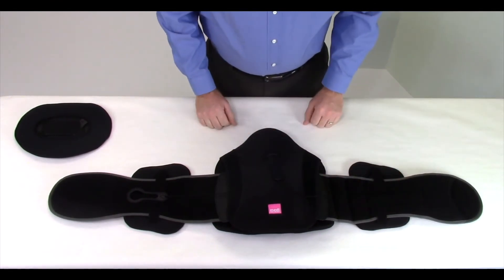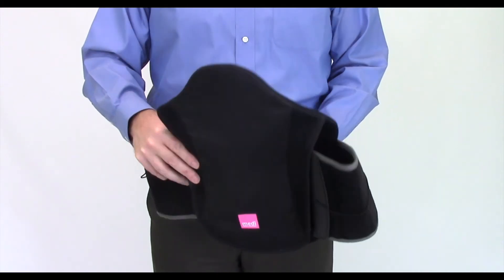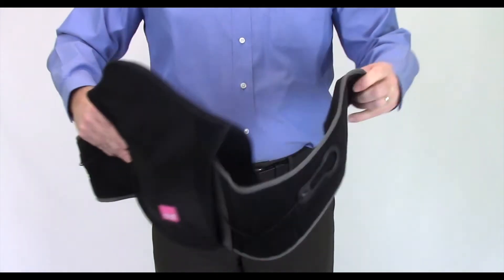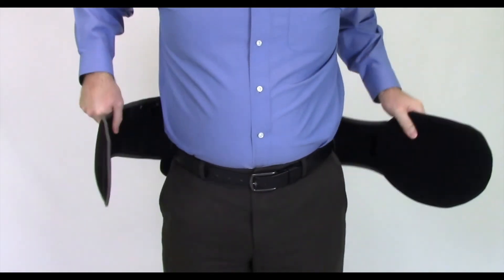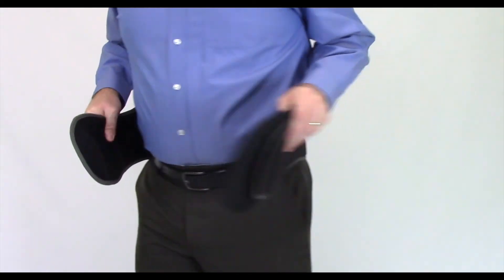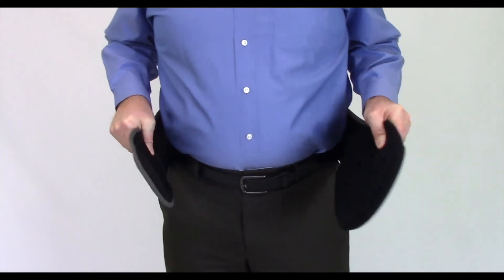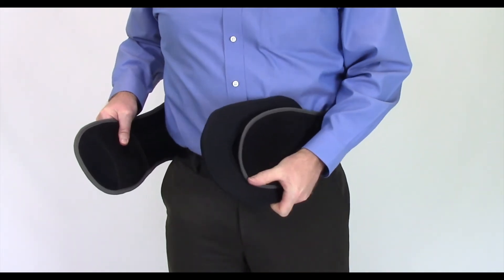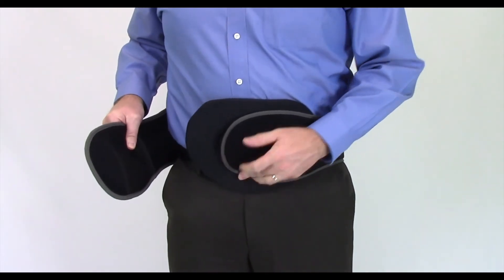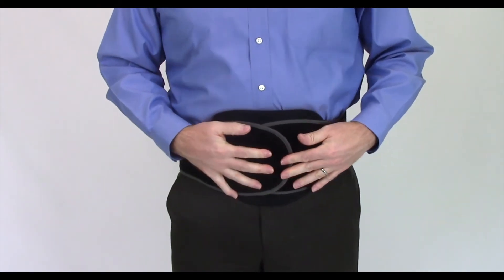Now, continue the fitting process. To put on the device, place it around the lower back so that the medi logo is centered, upright, and away from the body. The wrap panels should sit just above the hip bones. Pull the left wrap panel around to the front first, followed by the right, and fasten the right panel over the left.